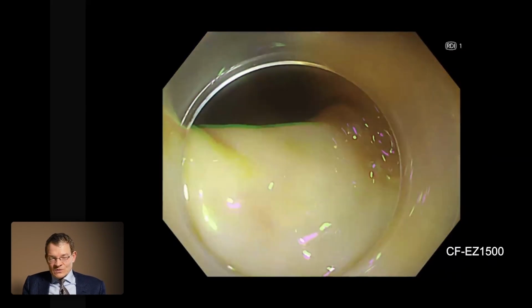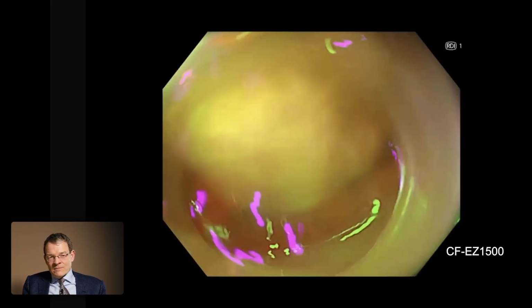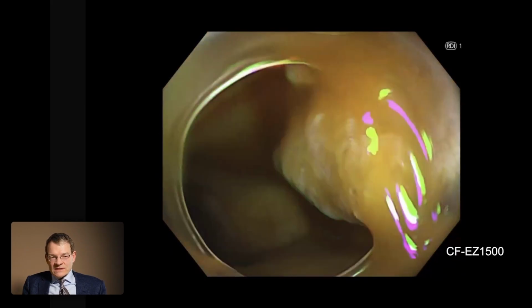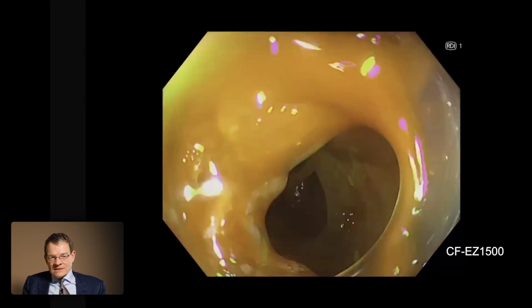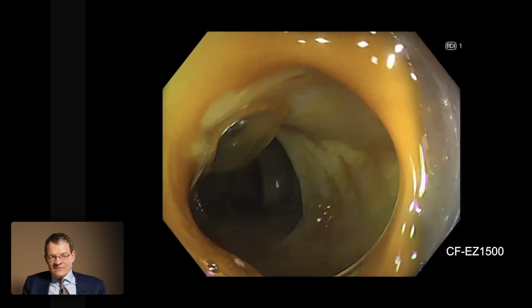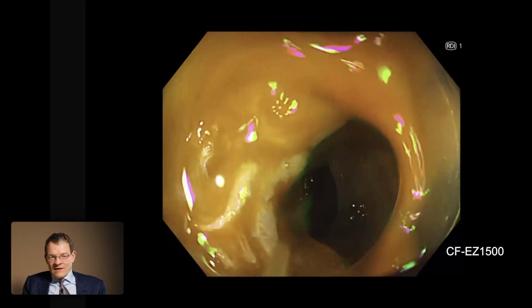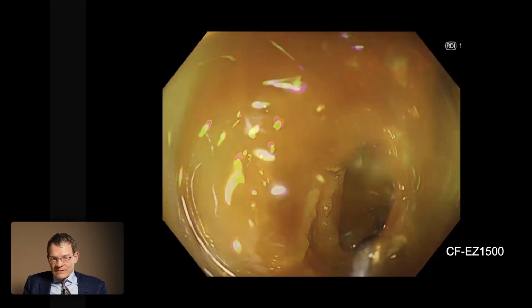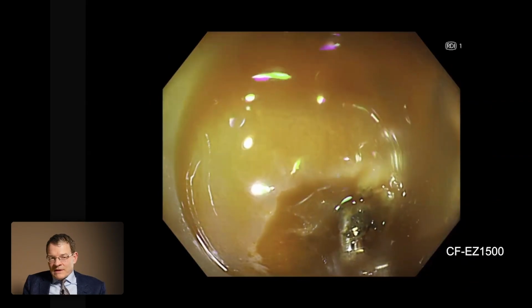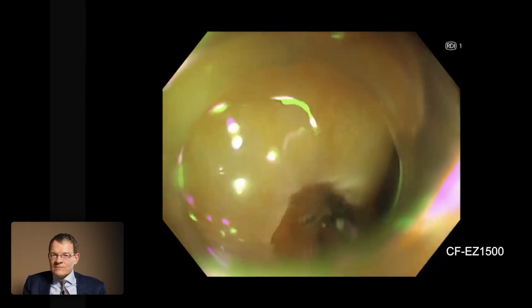I'm also using the cap, and now I'm carefully retracting the endoscope, and now you will nicely appreciate here on the left side there is a huge arterial vessel heavily bleeding, and I think it's also a nice example that you can manage this situation easily by using RDI.